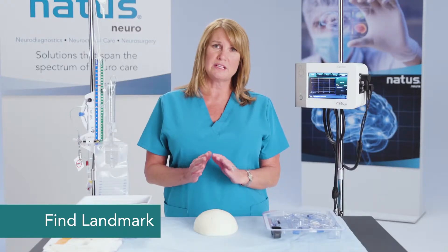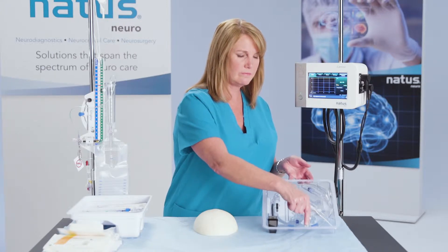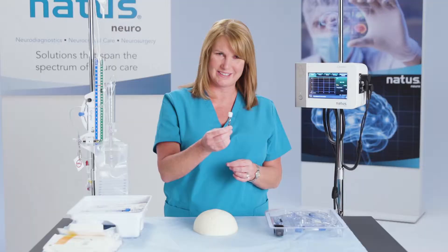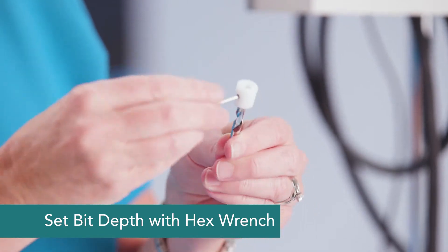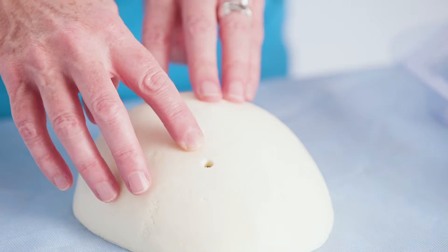The first thing you would need to do is prep the patient like you normally would, finding the location where you want to place the catheter. You would do an incision through the scalp, and then make a burr hole of the appropriate size for the bolt. This bit is the appropriate size for the bolt, so the bit in the kit will make the bolt fit. You'll use the hex wrench to get the depth stopper out of the way, then attach the drill bit into a hand drill to create the burr hole. For demonstration purposes, the hole has already been created.